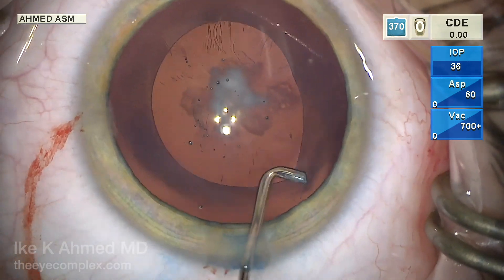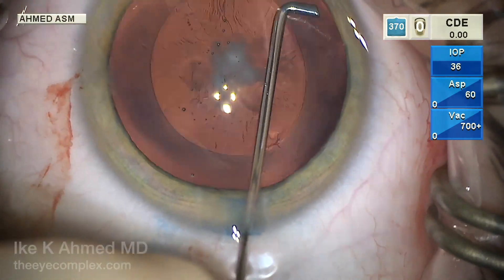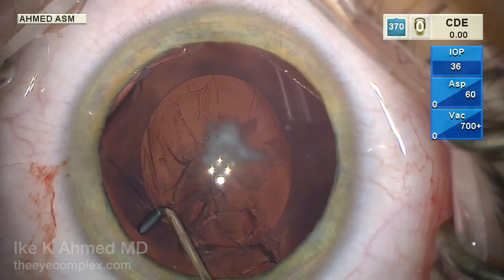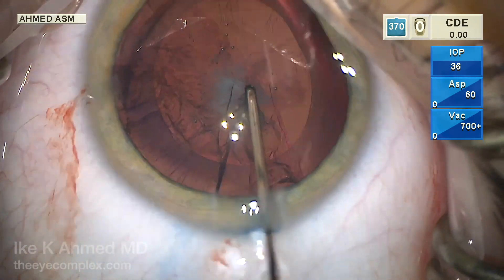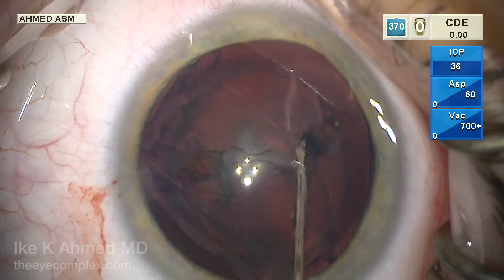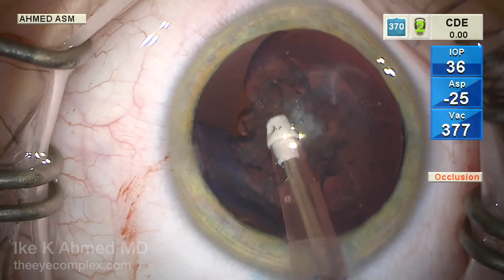This is a posterior polar cataract. We want to avoid any kind of hydrodissection. Instead, this is more manual cortical disruption, displacing the cannula underneath the anterior capsule to disrupt the anterior cortex to facilitate removal — but there's no injection here, as we don't want to risk blowing up that posterior capsule. We will do hydrodelineation, though, which helps to separate the endo-epinucleus in a multilaminar fashion, facilitating segmental lens removal.